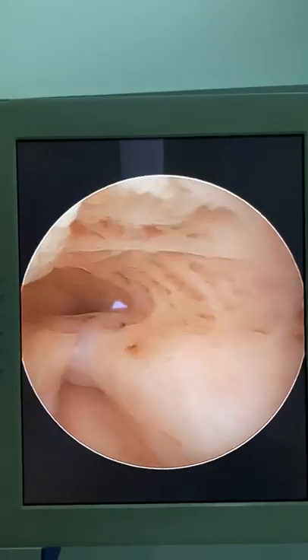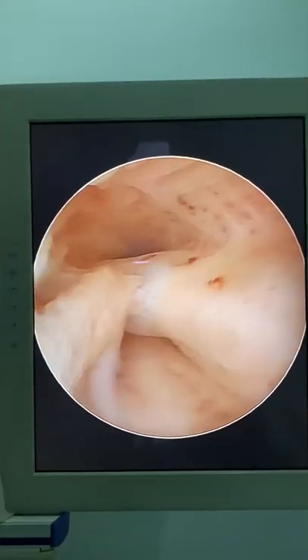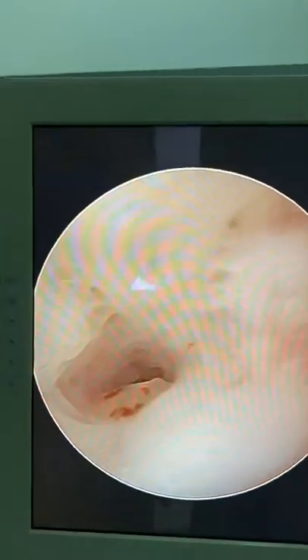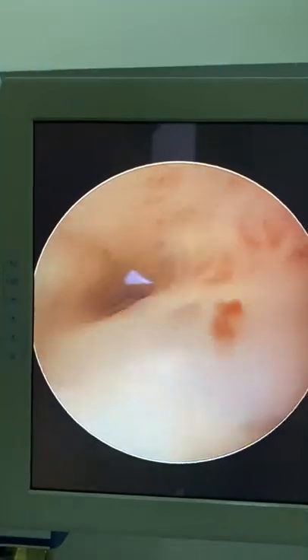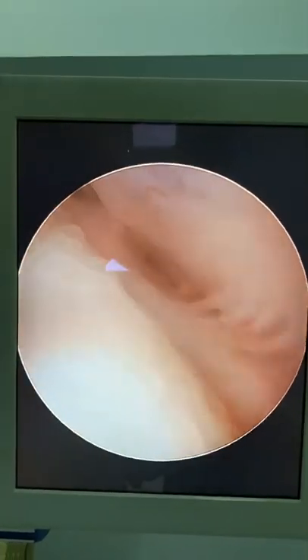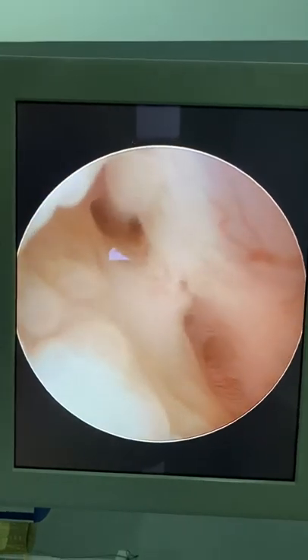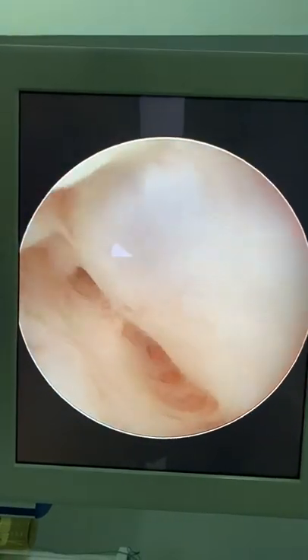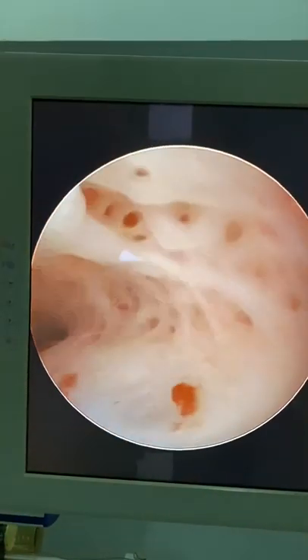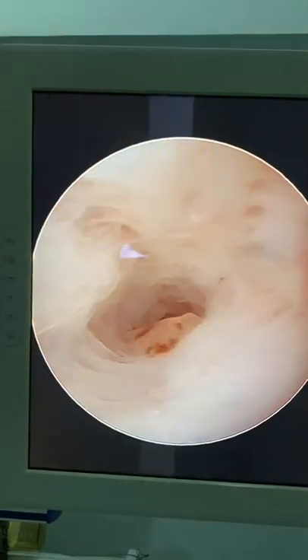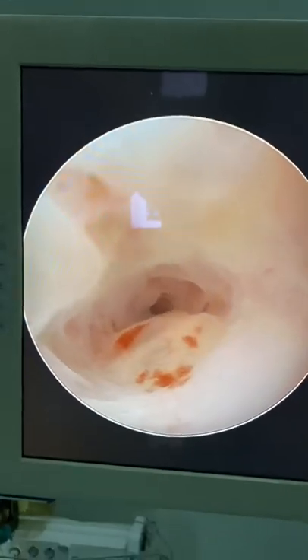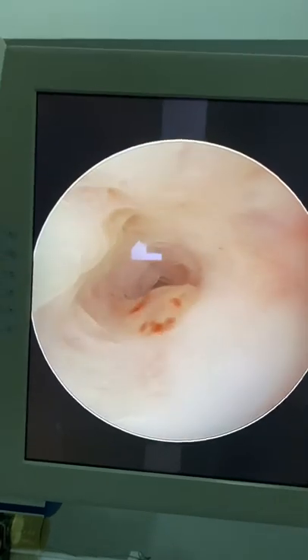What should I do now? Take one side and go. This is one side. I think you should cut it first here. No, I think this side is more false — I think the other side is proper. Increase the intrauterine pressure please. You can dilate the internal os by scissors if you like. Give me the scissors please.